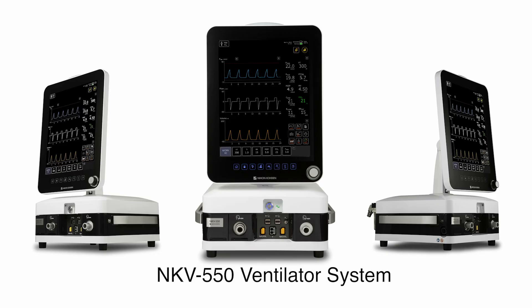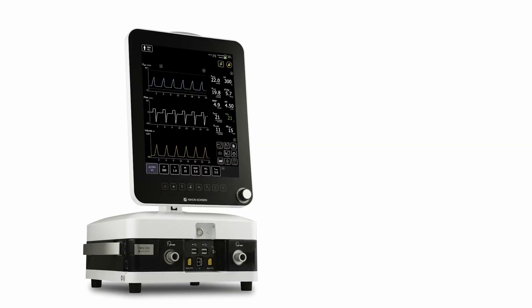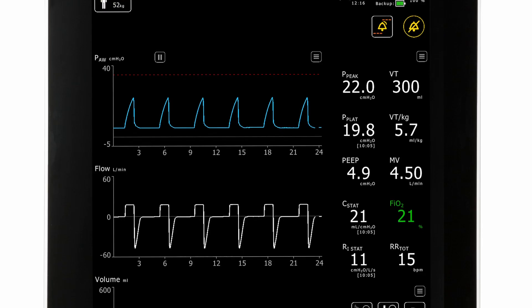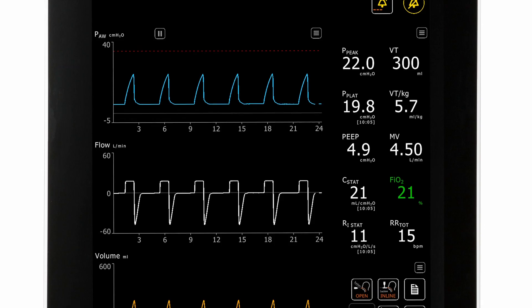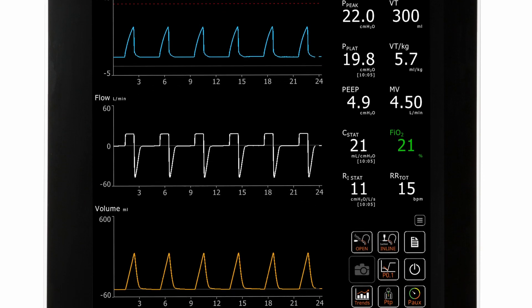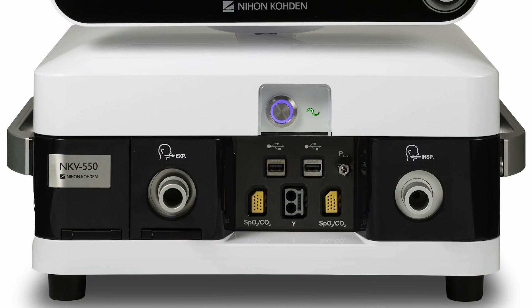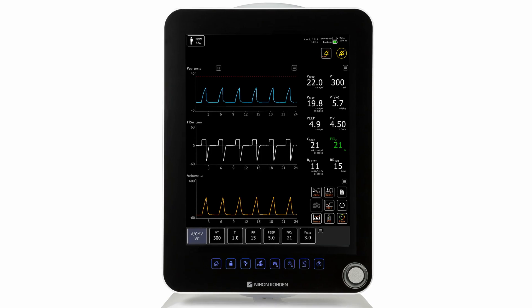The Nihon Kohden NKV-550 ventilator system is intended to provide continuous ventilation for adult, pediatric, and neonatal patients who require invasive or non-invasive respiratory support. The main system is comprised of two components: the breath delivery unit and the graphic user interface.